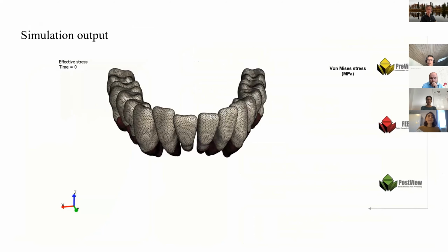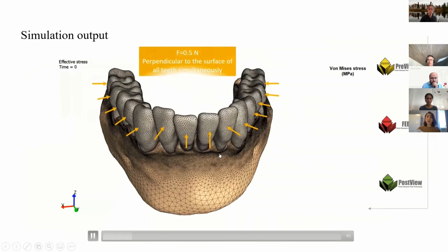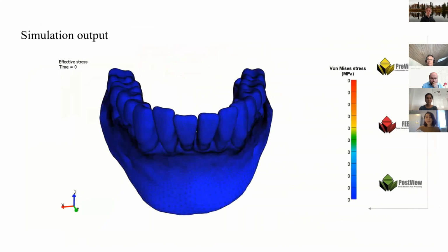Here, we have a short demo of how we are applying the forces in order to mimic the uncontrolled tipping scenario by applying the forces perpendicular to the surface of the teeth simultaneously.